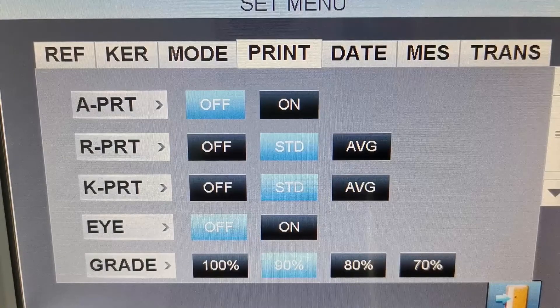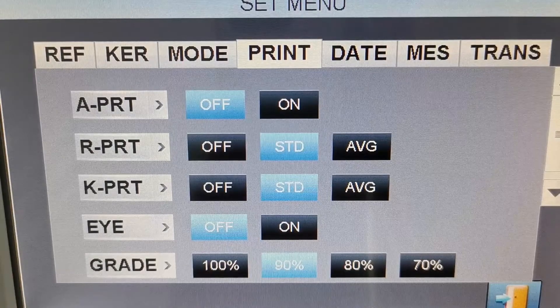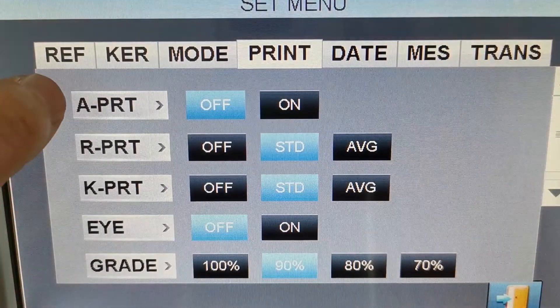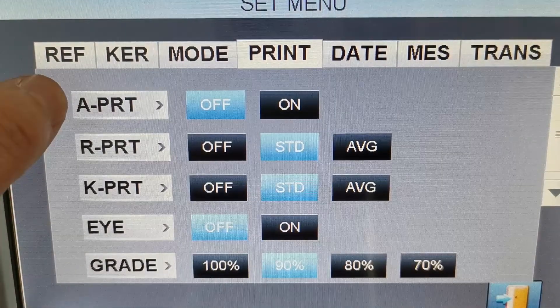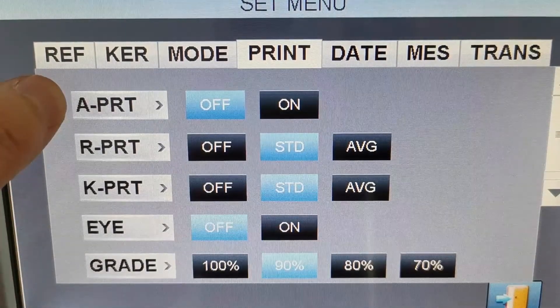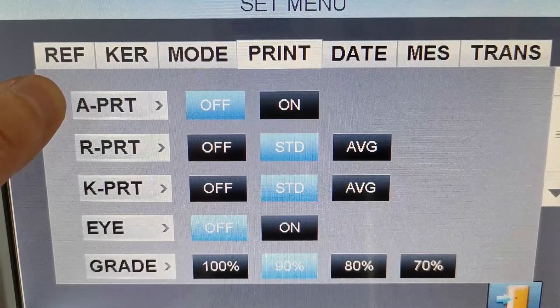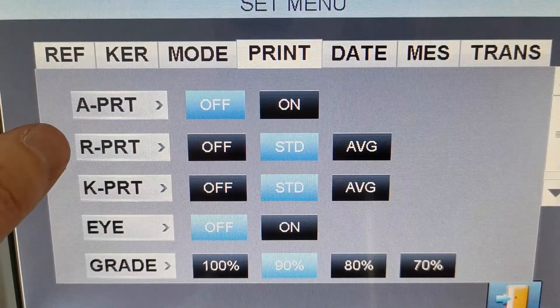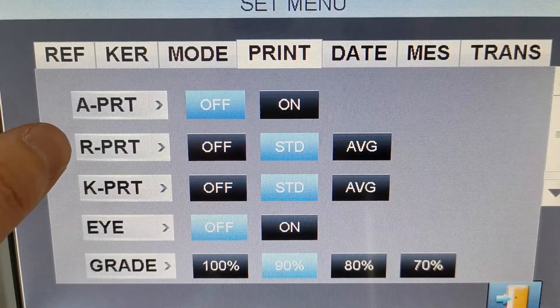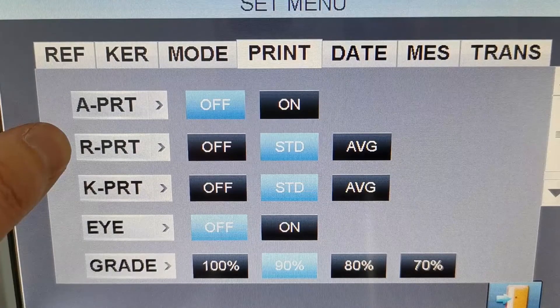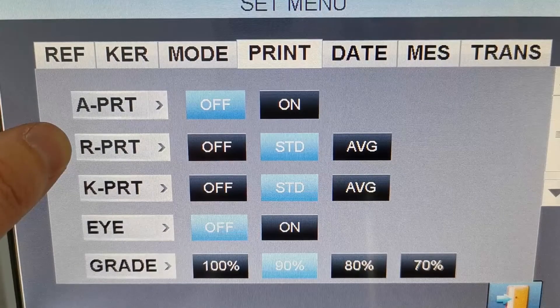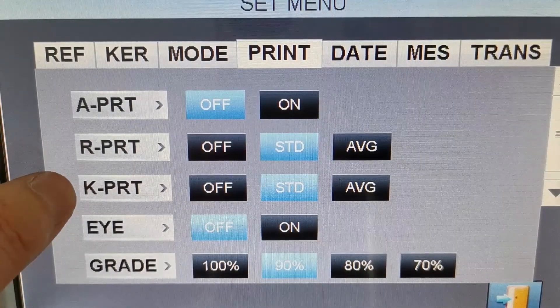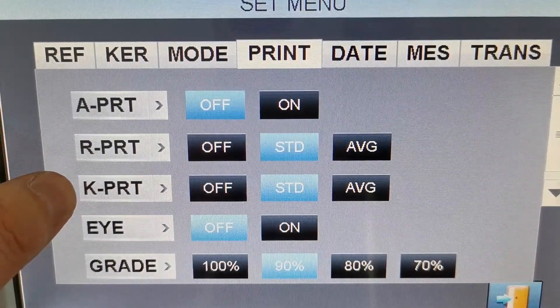Here is the printing setup. The first option is the auto printing function — you can turn it on or off. The second one is printing for refractive data, and the third one is for keratometer data.